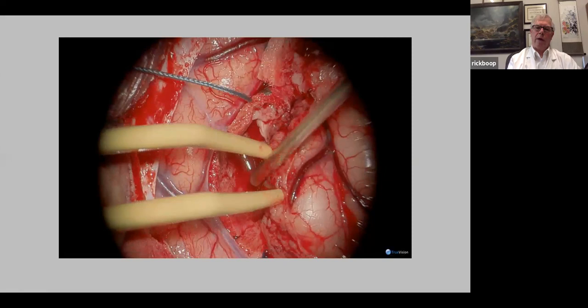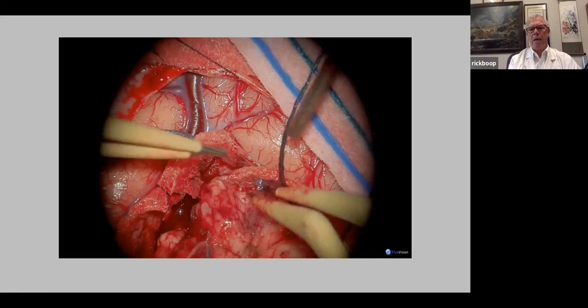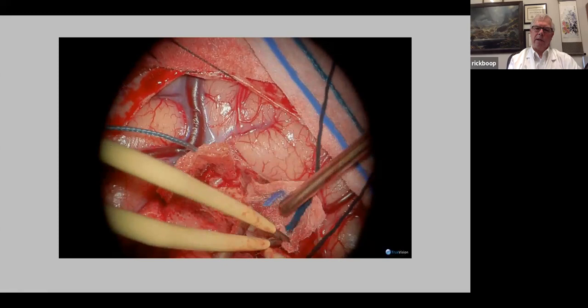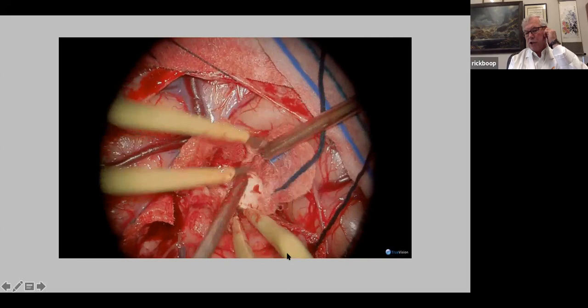generally we're either able to measure a depth by preoperative MRI or notice a textural or visual difference between the low-grade glioma and the normal subcortical white matter until we get all the way around the tumor. And once we've circumscribed the tumor, taking it away from the subjacent pia, then we can lift it out and have a specimen. It may infiltrate an adjacent gyrus, as you see here, and we may have to amputate at that level.